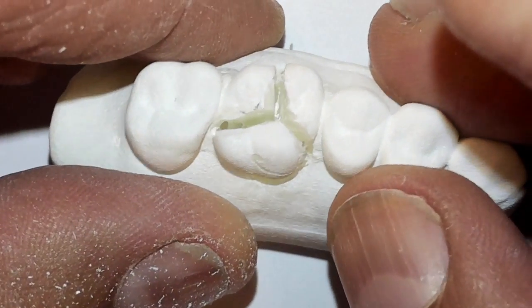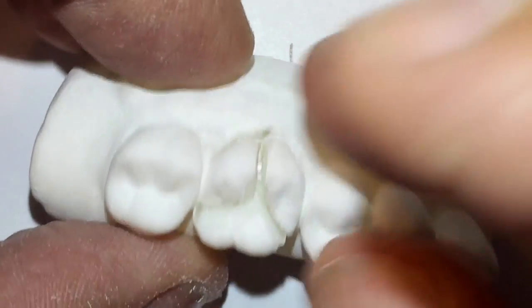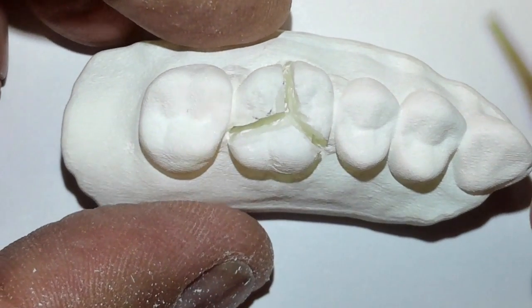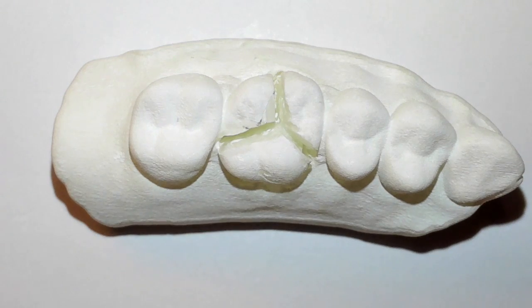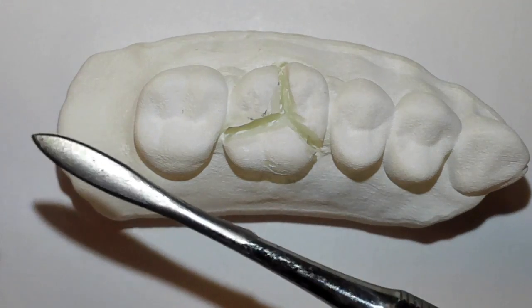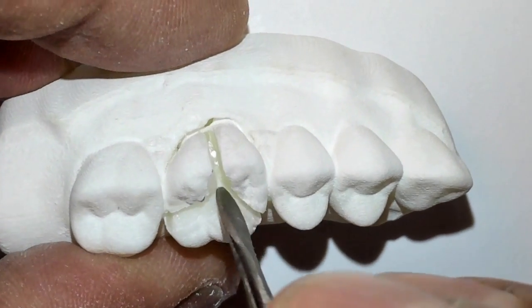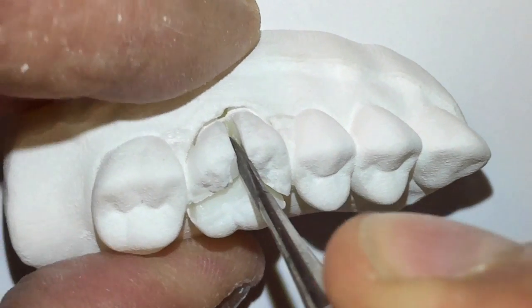So if we were grading this, we're going to make sure you don't nick an adjacent tooth — points off for that. Now when you get down in there, you should be able to see around. And if you see any daylight, you probably have the roots sectioned nicely. Then you can start with your instrument — we're going to go through instruments in a minute. Actually, I have the number seven spatula that you'll be using. The idea is to luxate. What does luxate mean? You're going to place the device in there and you just start to separate until you hear a little crack.